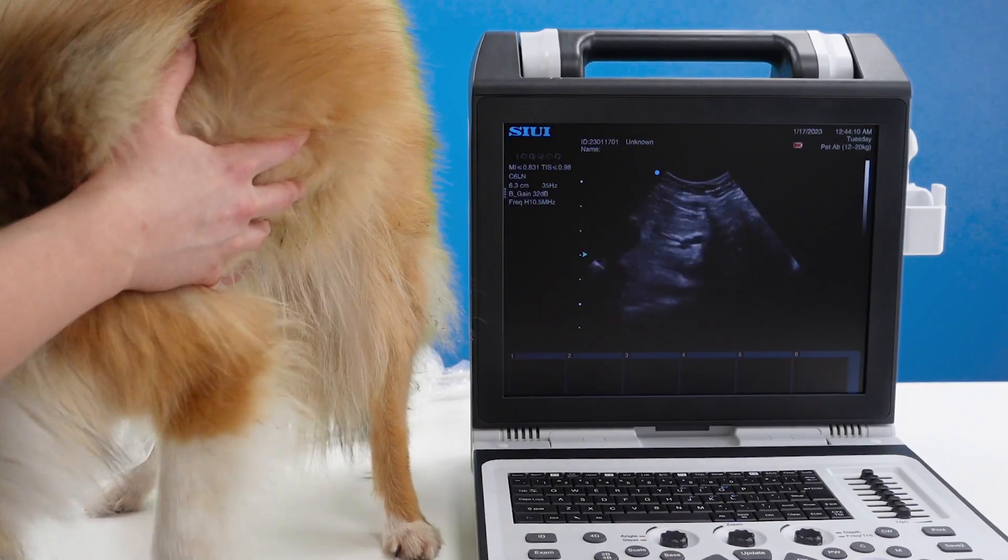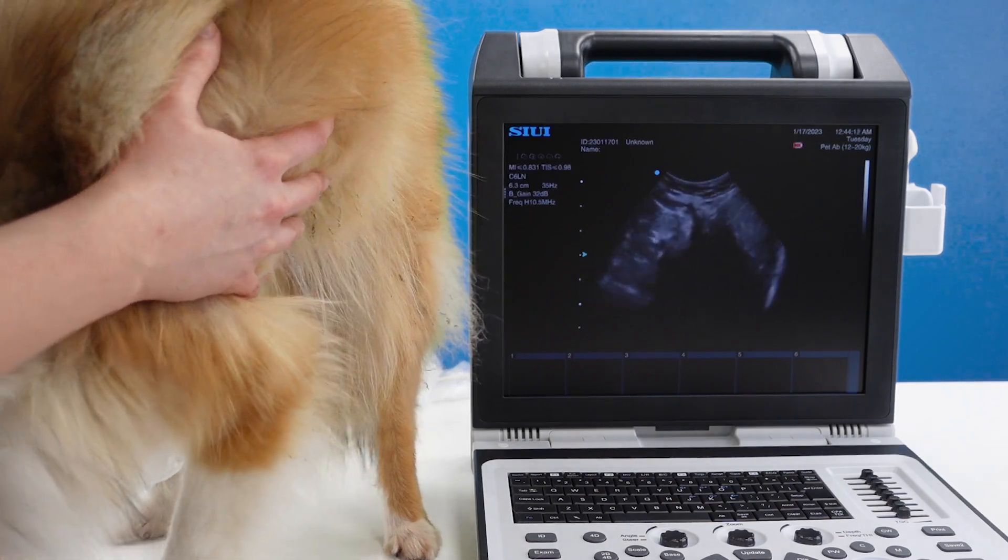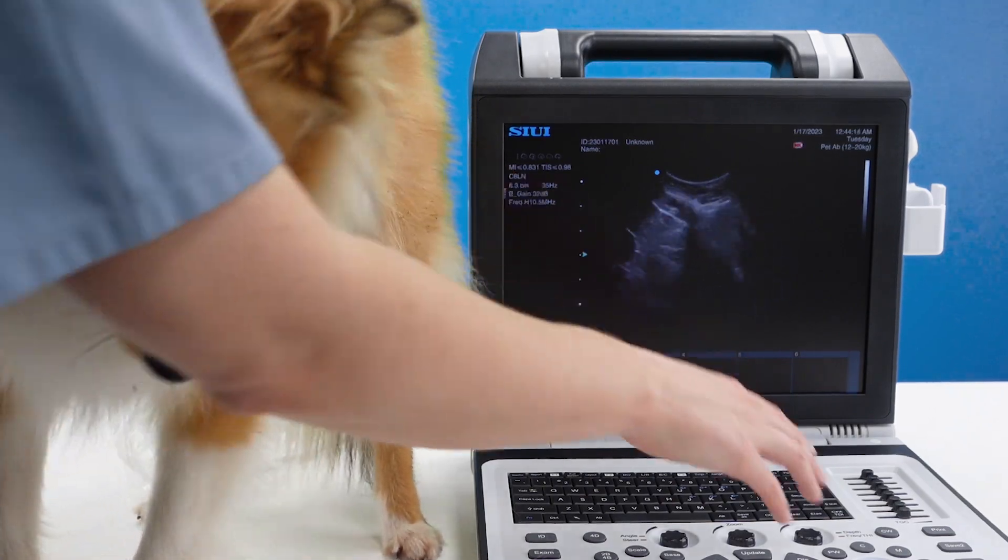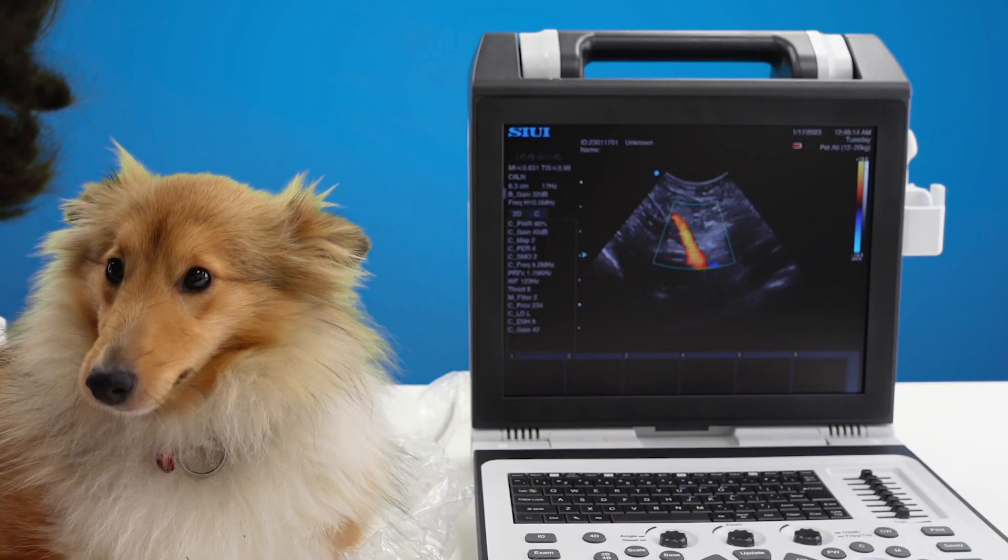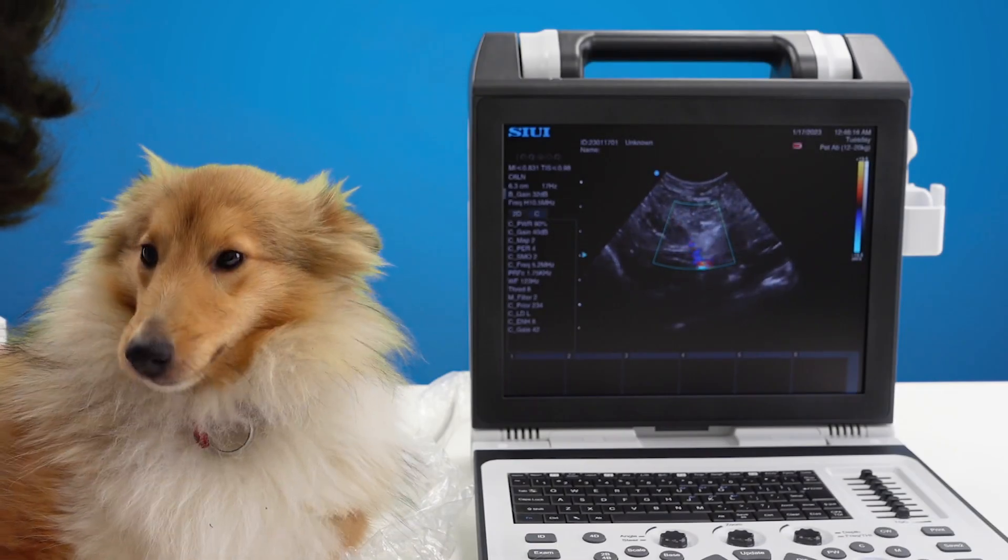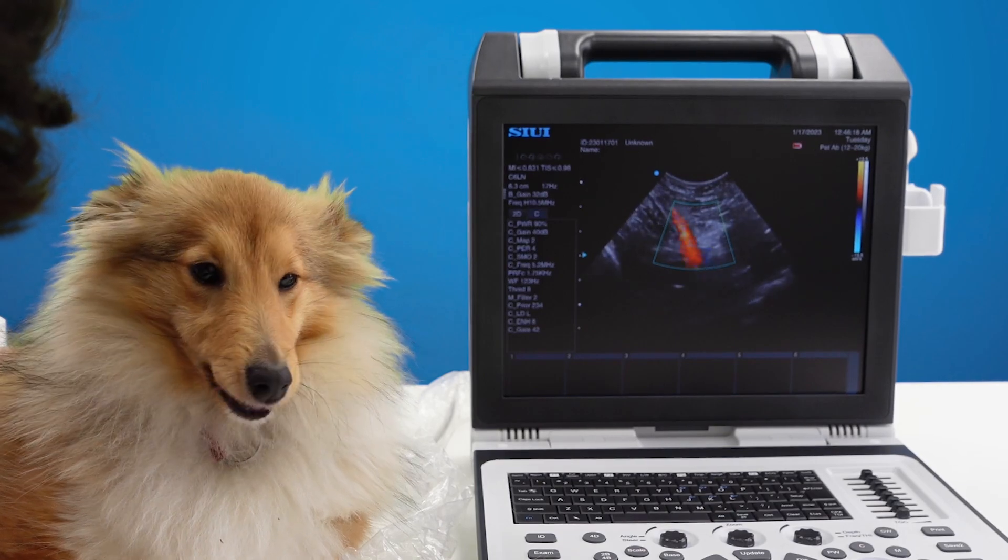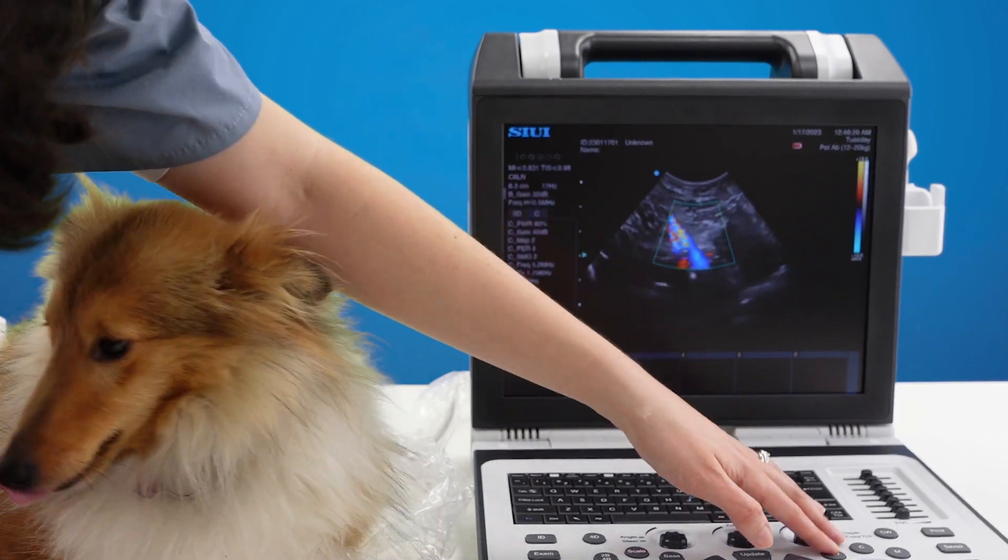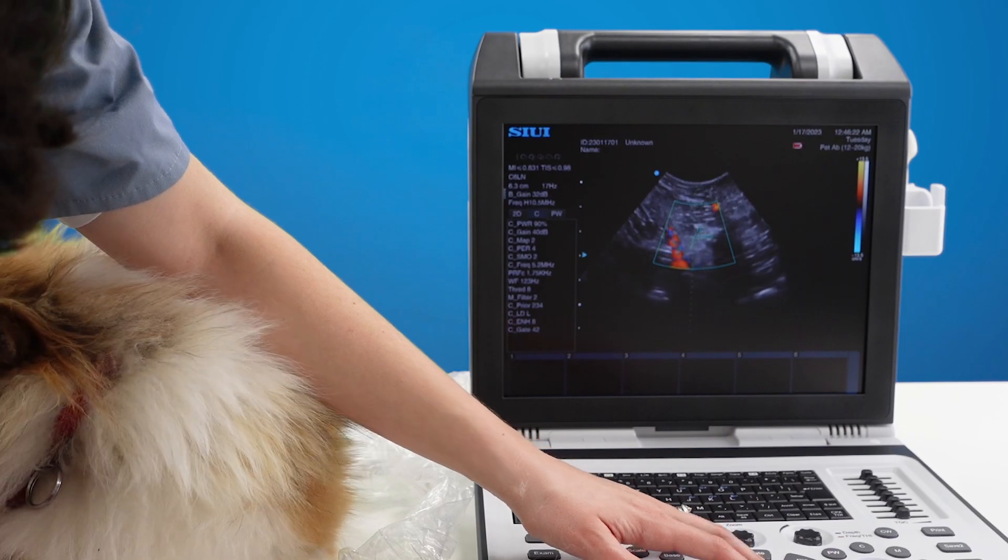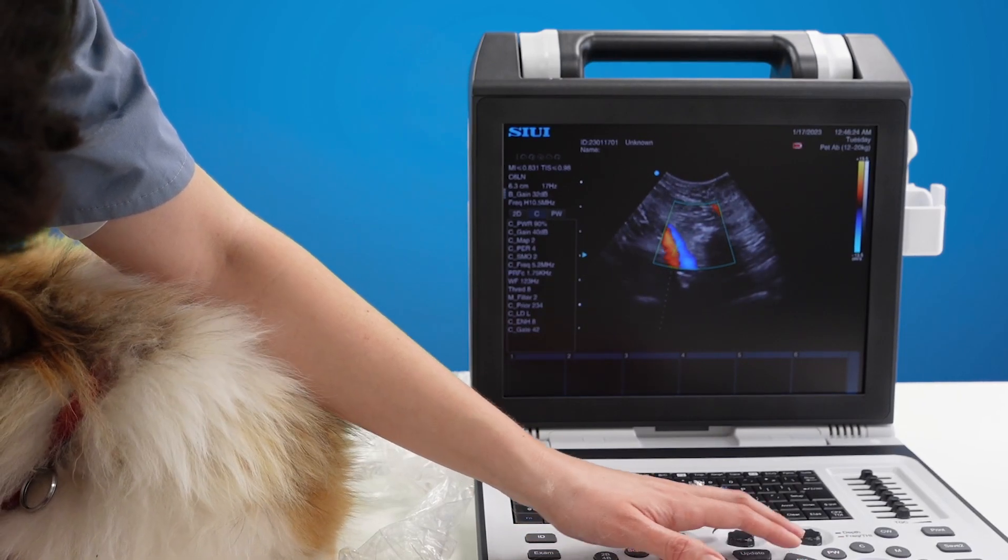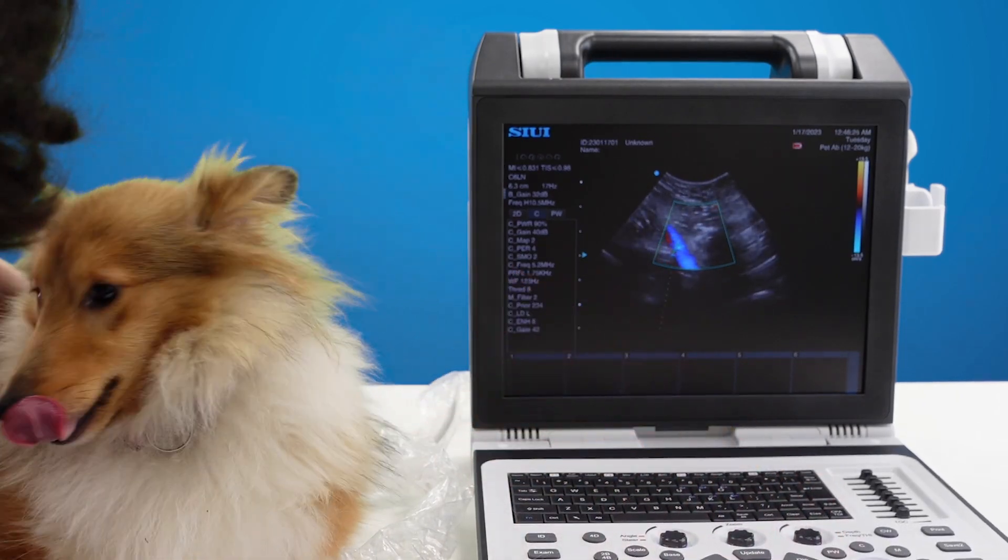To turn your colour Doppler on you'll press the C button. Colour Doppler can be very useful to guiding your pulse wave Doppler placement. So press PW. Line your gate up and then press PW again.